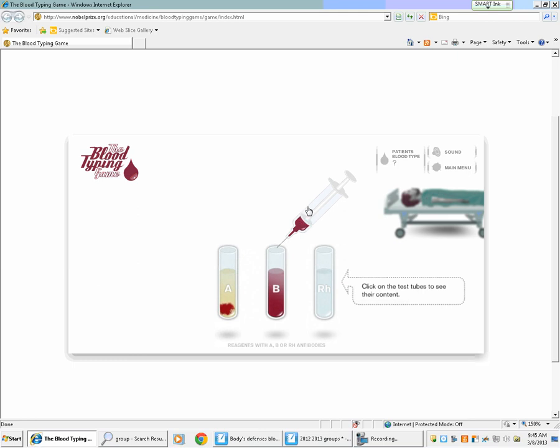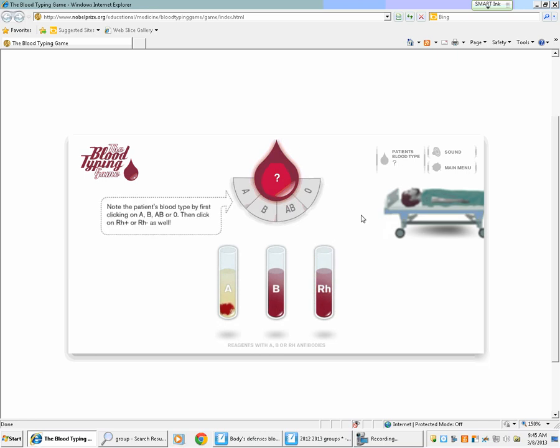Dr. Taylor, whenever you're ready, test the patient's blood in the RH test tube. The rest of you, including Dr. Taylor, complete your conclusion as well as what types of blood can be used for the transfusion. Dr. Taylor, take your seat.